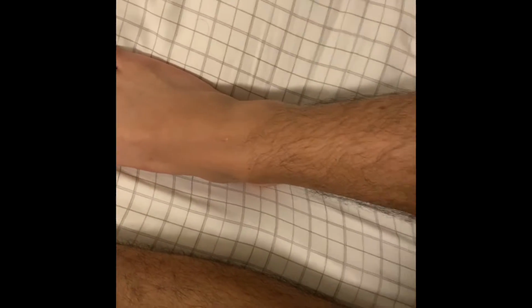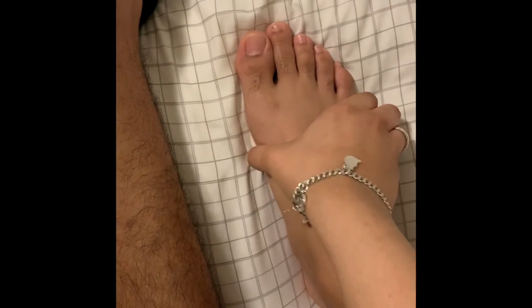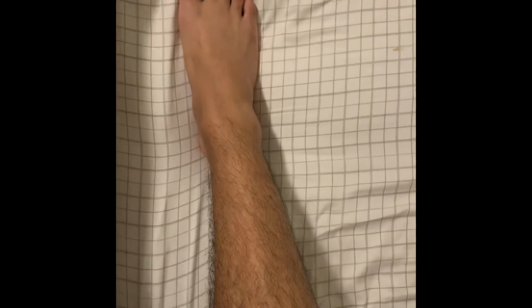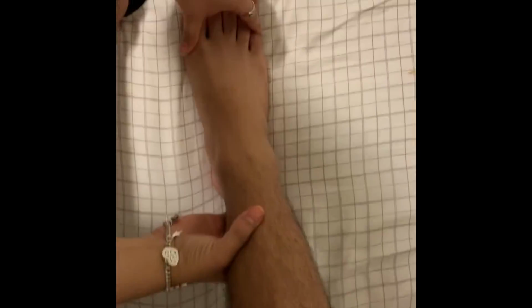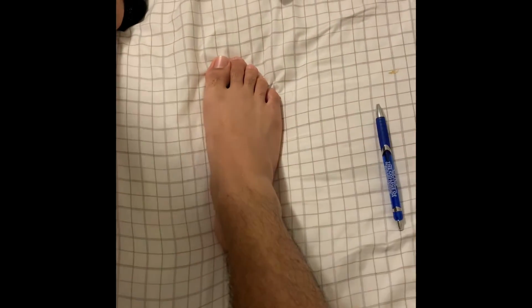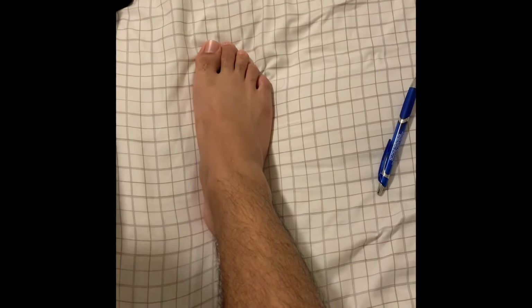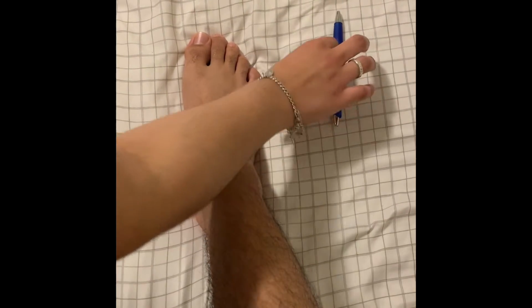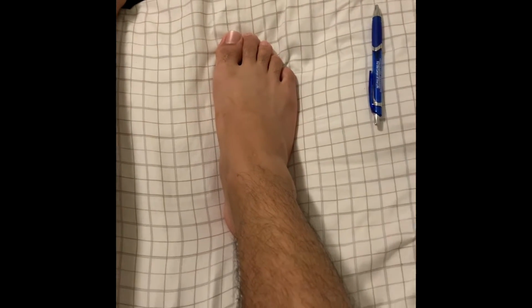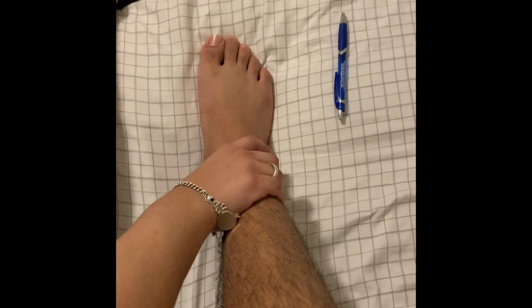And then I'm also going to be showing the positioning of the foot for the radiograph. So I'm going to be doing this on the foot. You can hold the phone for me, please, up here, like that. Yeah. Okay. So this right here is going to be my marker, which I'm going to be placing on the right foot so that it can be on the x-ray. So we're going to place the foot here.